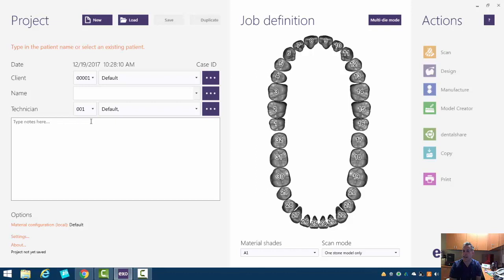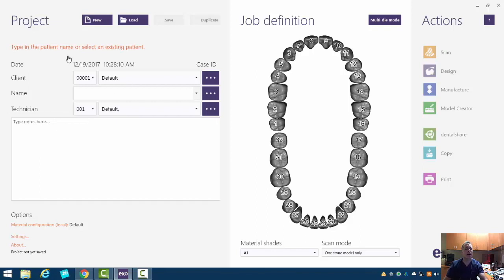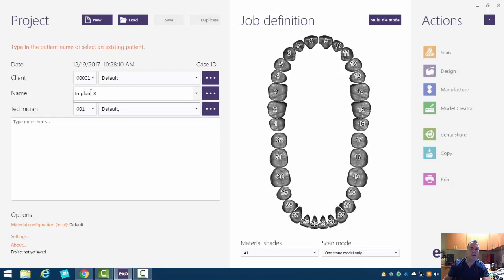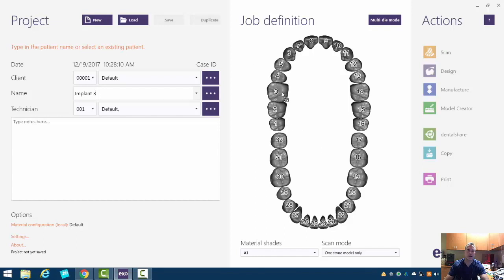But ExoCAD is coming out with a chair-side version, which I'm kind of excited about, that will hopefully simplify the process. But let's just go ahead and put in implant three for this case. And we're going to select number three over here under the job definition screen.